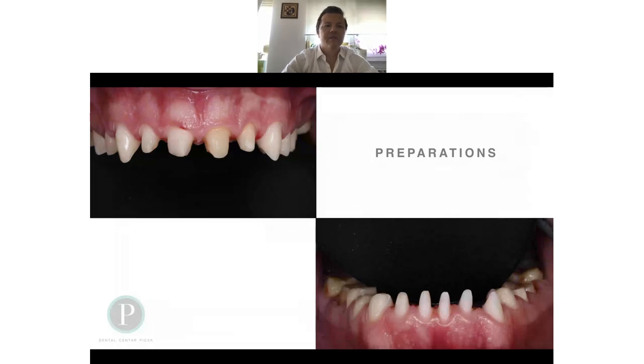If you, for example, see the upper jaw, tooth number 2-1, there is a small fragment which you need to replace with composite. But when I do, there was the part where all the direct restoration was there. I have a good cement, and I don't fill this with composites. I align on the cement, and the cement will fill this kind of cavity.